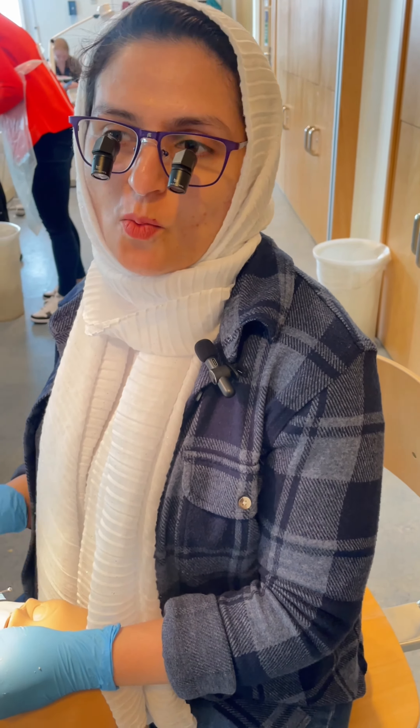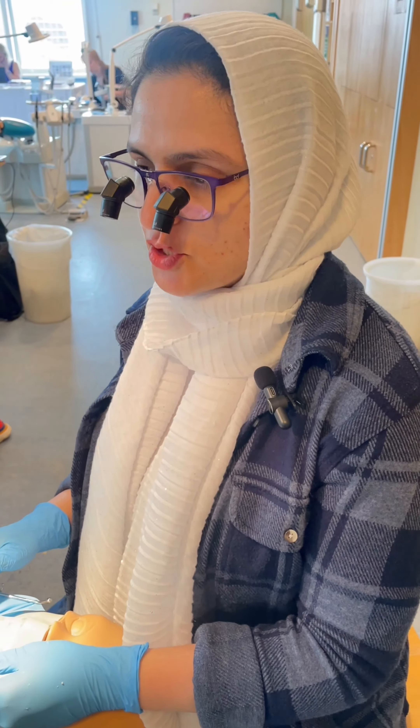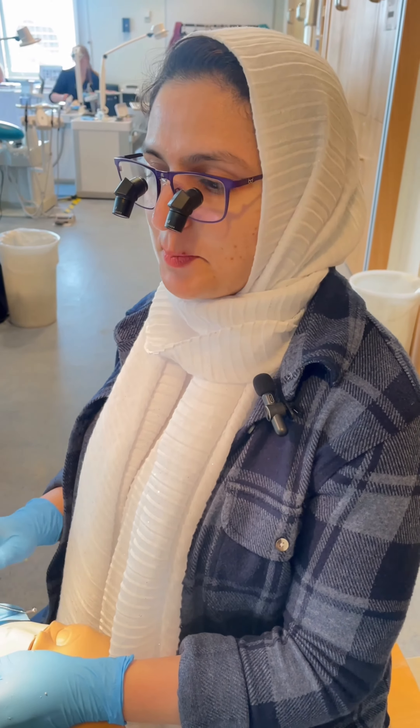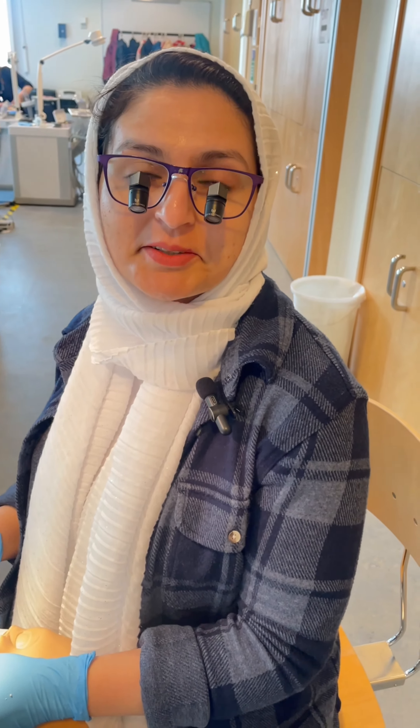Even with the loops on, I used to find myself straining my neck, and sometimes I have to move the head up and down. But with this one I find it so stable for my neck — much, much better, definitely.